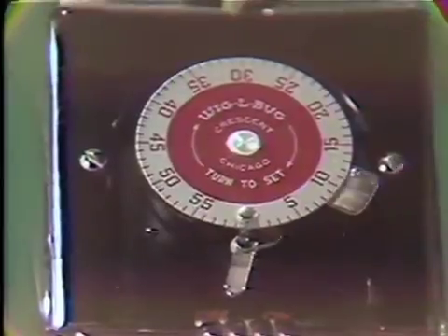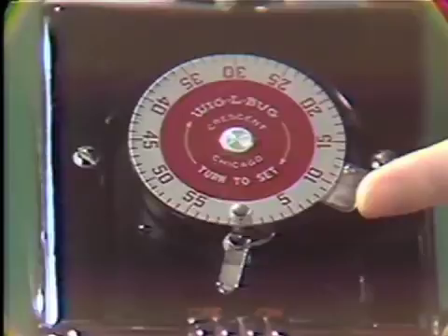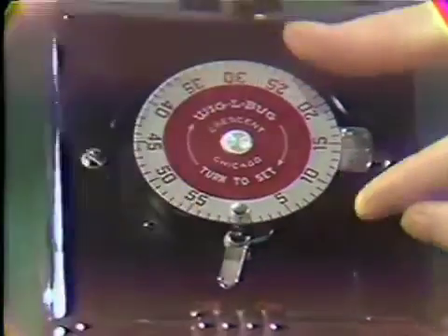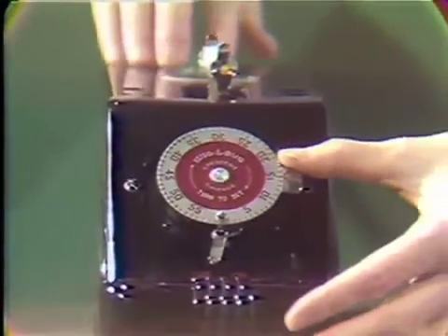By moving the adjustable stop tab, the timer can be set for the amount of time to be mixed. Using a single spill, the timer will be set for 15 seconds. Pull the stop tab to the on position, release, and allow the amalgam to mix.